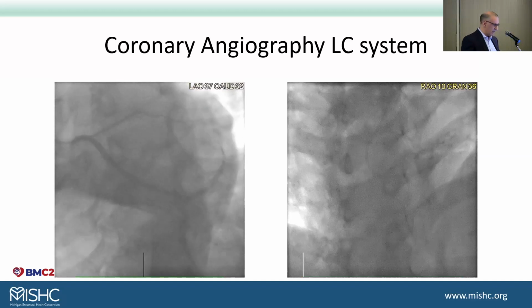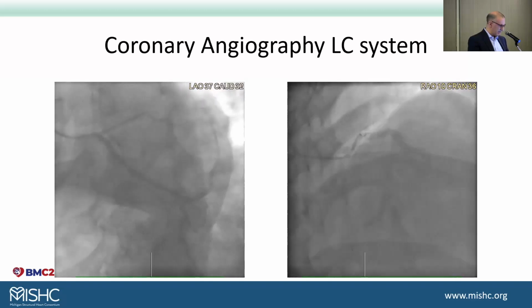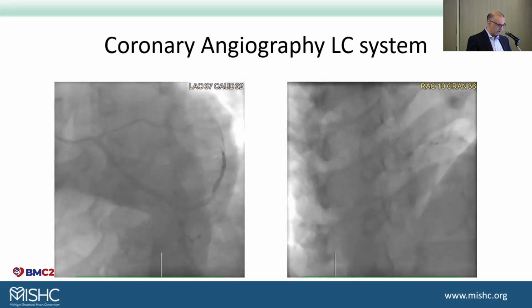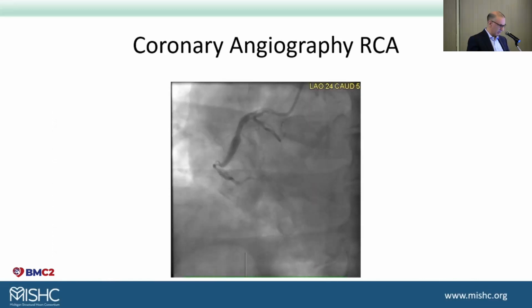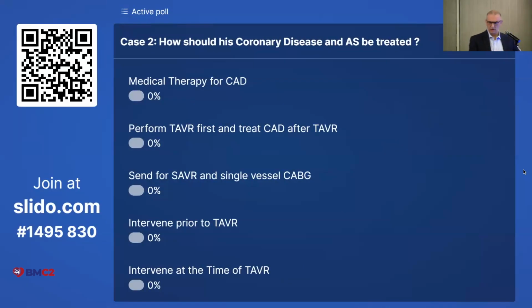So here is the patient selectively engaging the circumflex. You can see you're filling the RCA. The LAD, again, has no significant disease and the circumflex is occluded. And again, same questions as we had before. And then I get to the meat of my discussion.